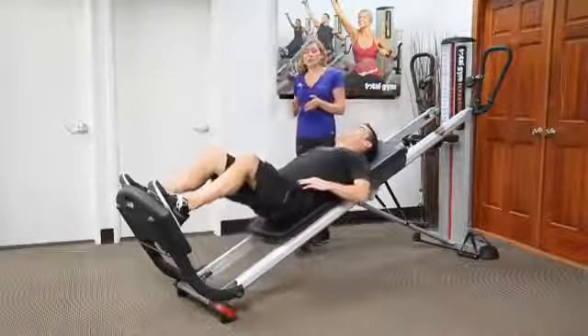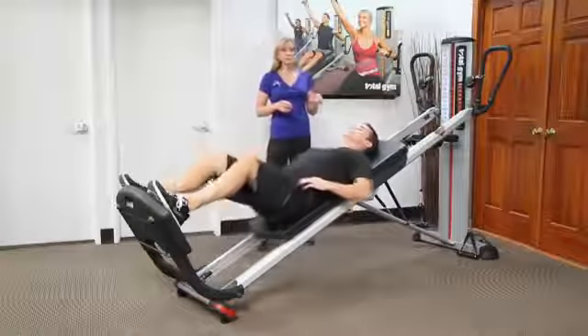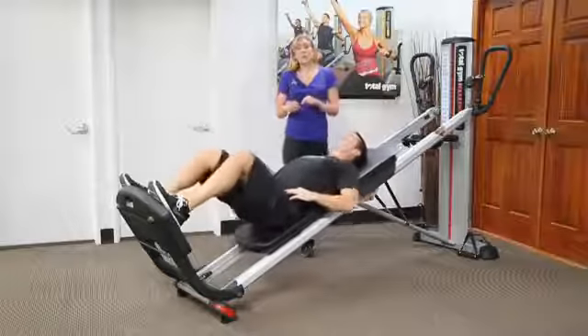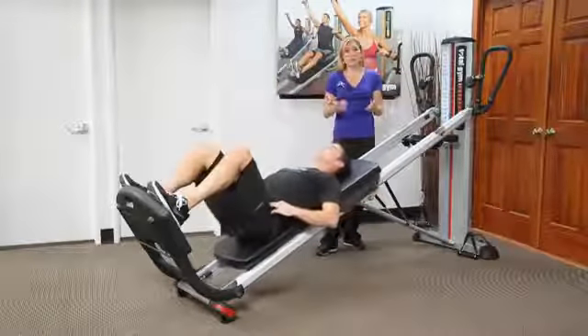When we're talking about strength, the higher you go, sometimes the exercise becomes harder or easier. With reference to squats, or really when the glide board is moving, the higher you go, the harder the exercise becomes.